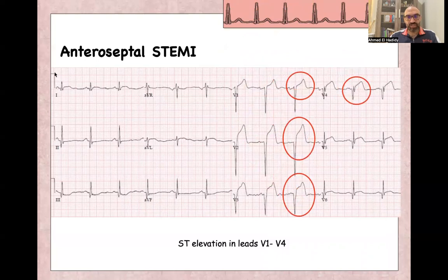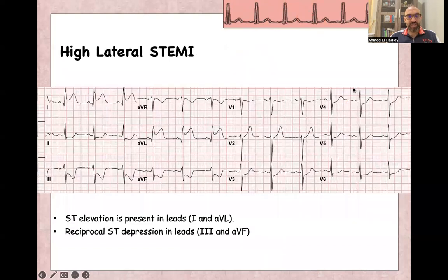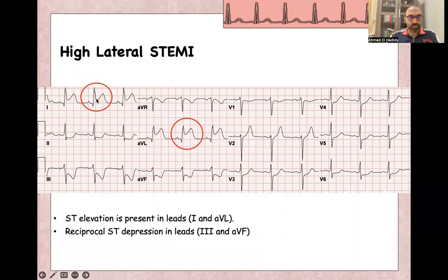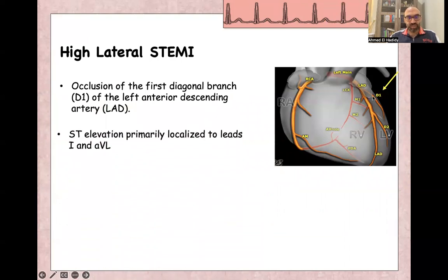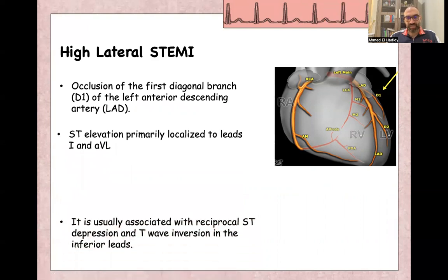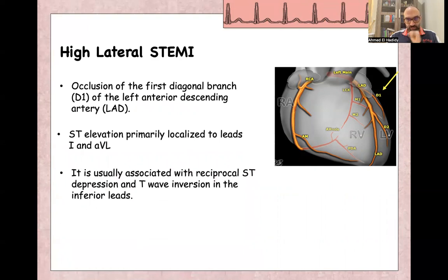For anteroseptal STEMI, there is slight elevation in V1, with obvious ST elevation in V2, V3, and V4. For high lateral ST elevation MI, there is ST elevation in lead 1 and AVL, with reciprocal changes in inferior leads — ST depression in leads 2, 3, and AVF. High lateral STEMI is caused by occlusion of the diagonal branch of the left anterior descending artery, leading to ST elevation in lead 1 and AVL, with reciprocal changes in inferior leads.